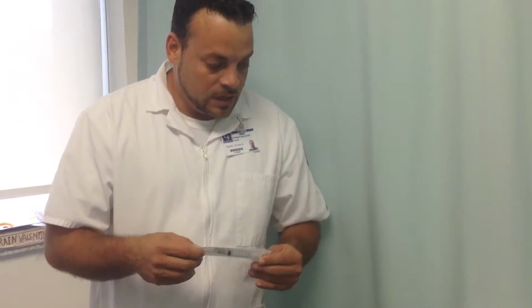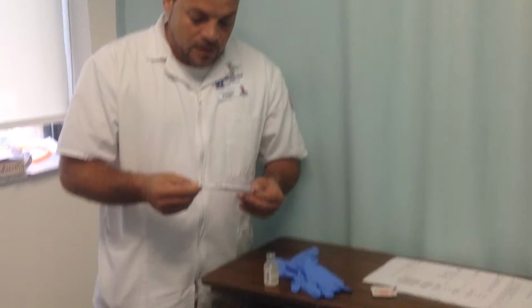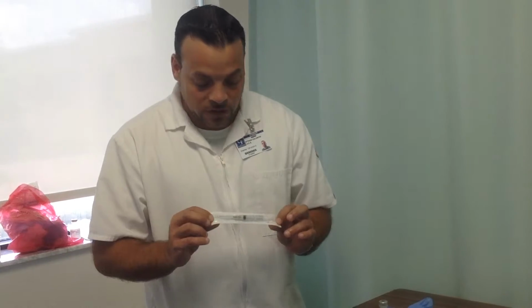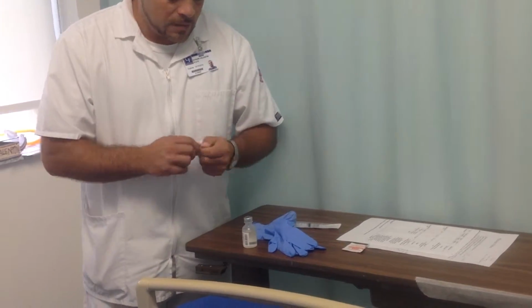We're going to need a needle in the range of 20 to 25 gauge and 1.5 inches long. And I have a 22 gauge here, which is 1.5 inches long, and I can get the proper amount that I need.